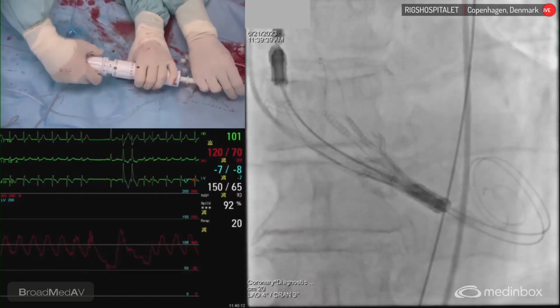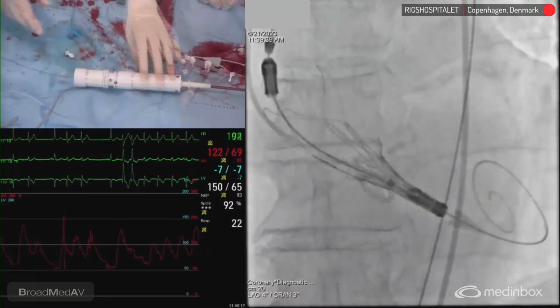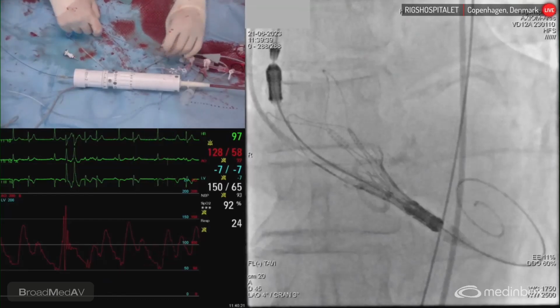Okay, give me the chance to push still. I'm definitely going to push. Yeah. Push 5 more millimeters. I'm quite a lot on the outer curve. Yeah, don't lose the time with that.